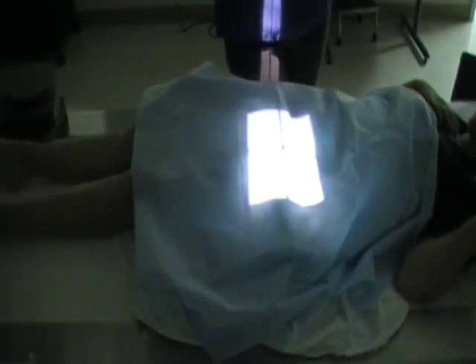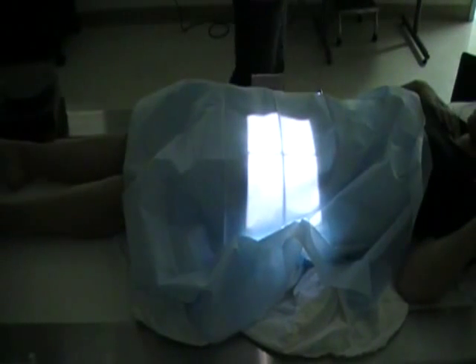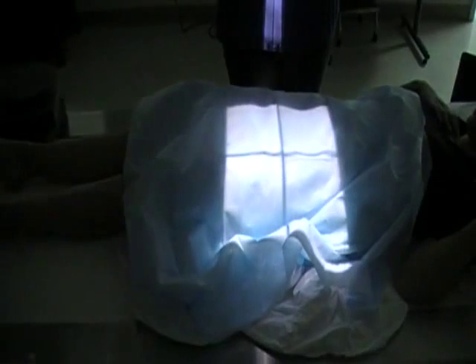Alright, now I'm going to straighten the leg out, and next we're going to do just the straight AP pelvis. So I'm going to change out my image receptors and use a 14 by 17. And we want to put the 14 by 17 in crosswise because that's the greater width of the pelvis. So you want to be sure that that is how you have the IR.